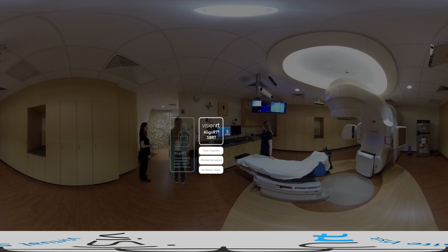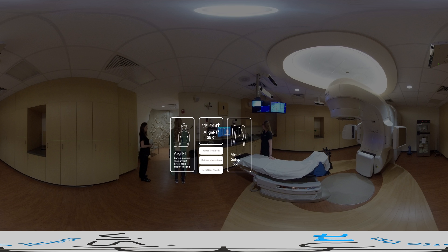When treating all IGRT patients, we use AlignRT to correct for any postural misalignment before radiographic imaging. This minimizes the need to reposition the patient and repeat imaging, meaning treatment is faster and interruptions to our physicist or physician are minimized. We don't use tattoos or skin marks, since AlignRT uses the patient's surface to register against the reference surface derived from the treatment plan. We like to call this surface a virtual setup tool.